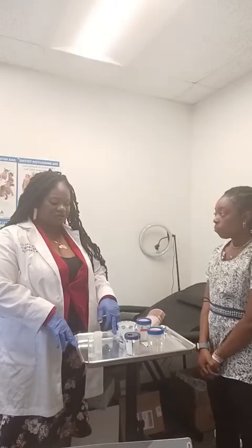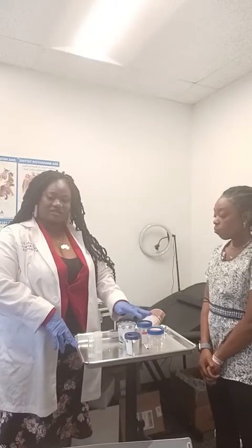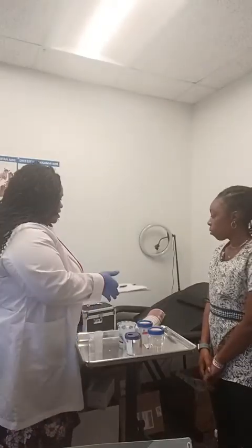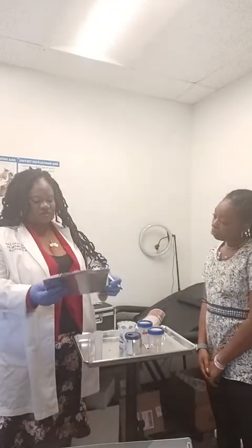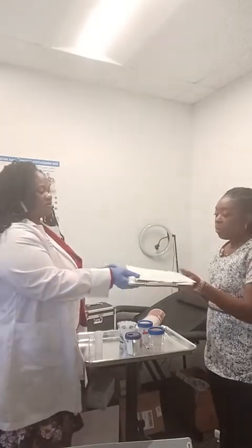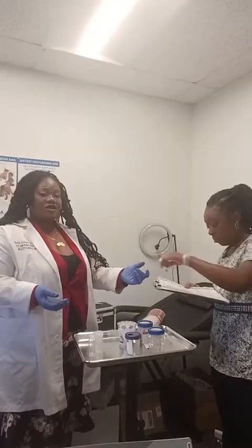So once that is done, we have the specimen collection. At this point, you have two choices. You can ask the donor. Actually, we're not going to use the second option. I'll just proceed. I'm going to ask my donor to complete step 5. Miss Isabel, could you please sign on this page? I need your signature, your name, your phone number, your email, and date of birth. Okay, I'll do that. Thank you.